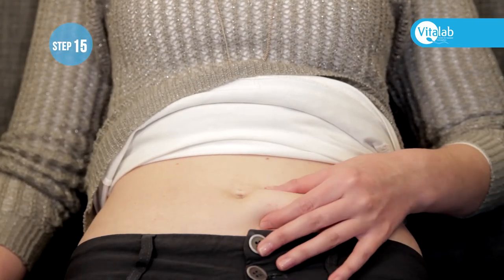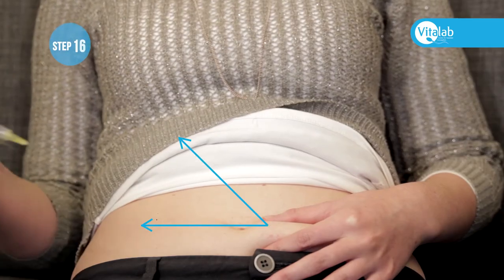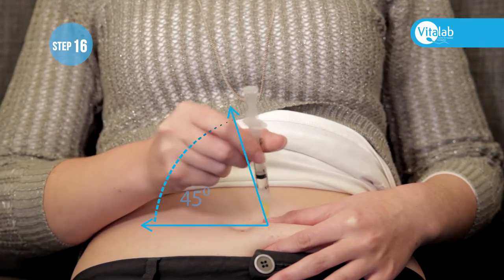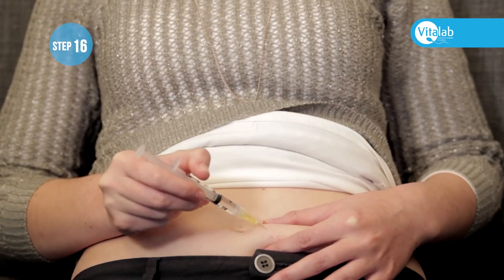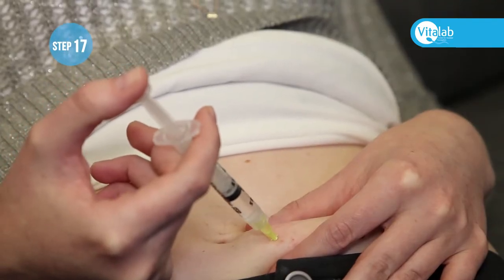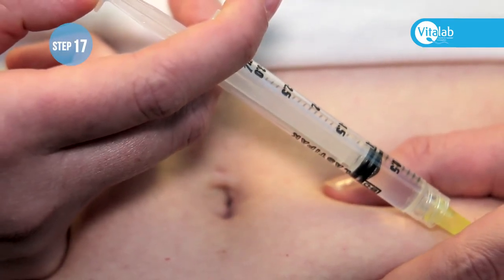Support the flesh between your thumb and finger — do not squeeze too hard. Push the needle into the abdomen at a 45 to 90 degree angle; the 90 degree angle reduces post-injection bruising. Inject the medication, ensuring that the plunger of the syringe goes all the way in and all the medication is administered.